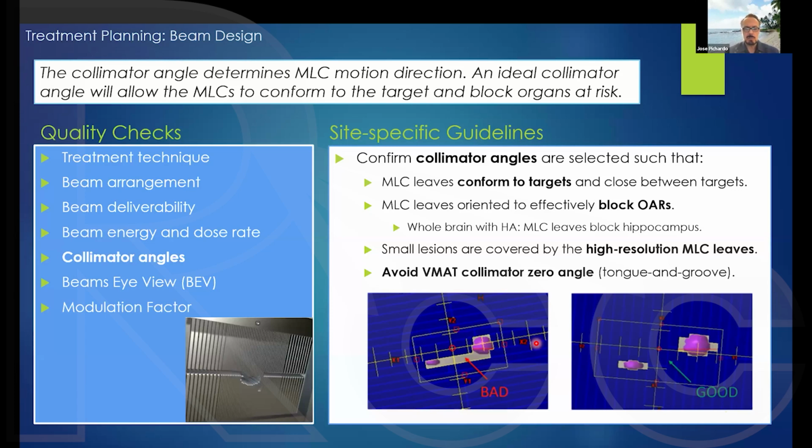Versus the actual dose, right? So when you're looking at constraints, always make sure you're looking at constraints that are appropriate for the number of fractions that you're delivering. Unfortunately, I don't really have answers about the hippocampus for SRS because, honestly, I'm going to start looking at it now, but I've never actually looked at it prior.